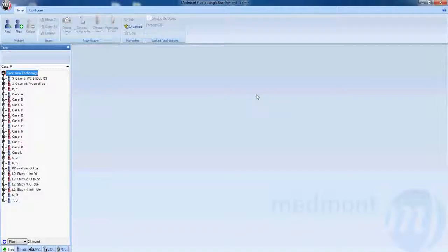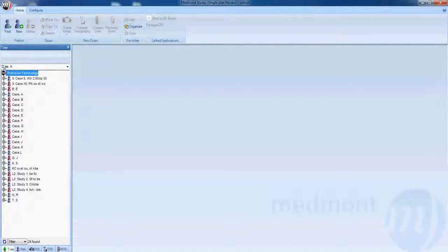This is video 4 on the basic operation with your MedMod E300 corneal topographer. You will note that your database is along the left-hand side, where all patient information will be stored.